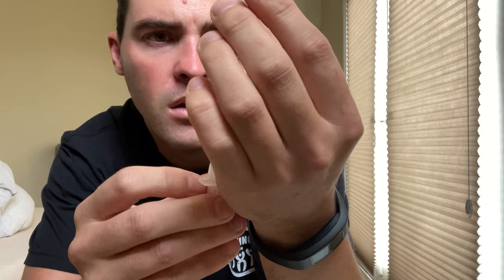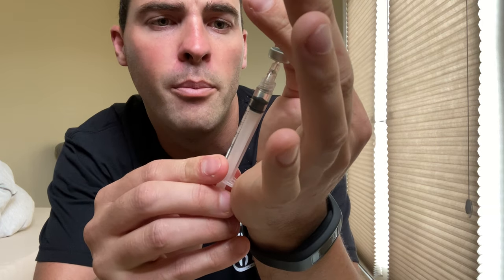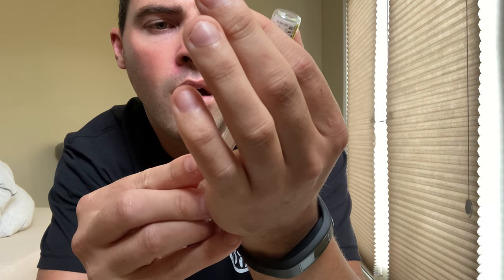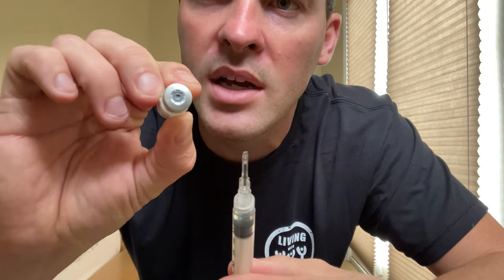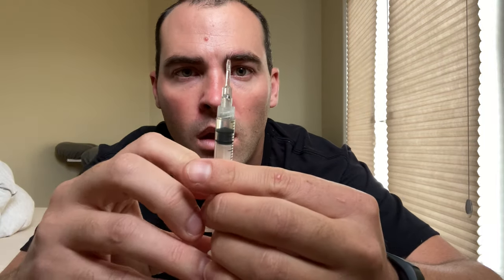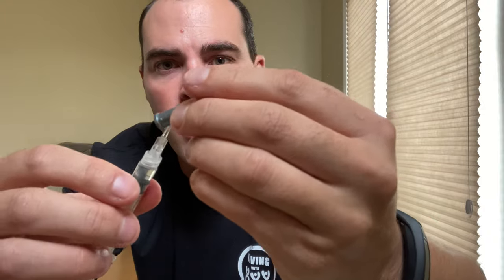It's really easy to pull the testosterone into the syringe — that's really easy. Oh, I forgot to push air into the bottle, and now it's like pulling the syringe back into the bottle. It doesn't actually make a visible hole, but it doesn't make a hole. So pull all the testosterone out and then put the cap back on.